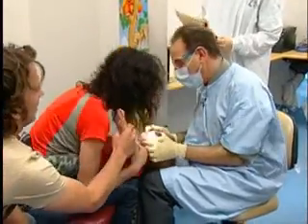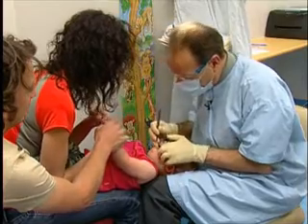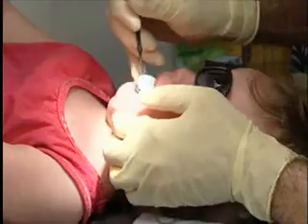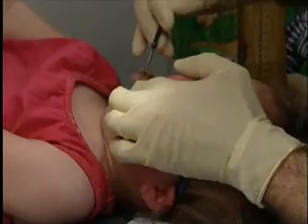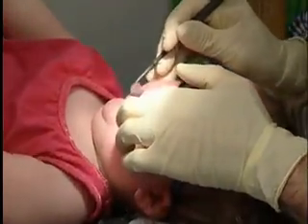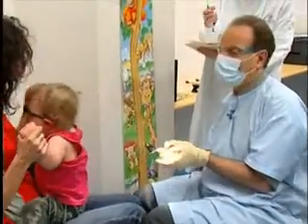Okay, sweetie pie. Open big. Let's have a look at these teeth. Open big. What beautiful teeth you have. Okay, let's have a look. Good girl. Okay, so we've got from D to D on the lower. Alright, we go up a bit.